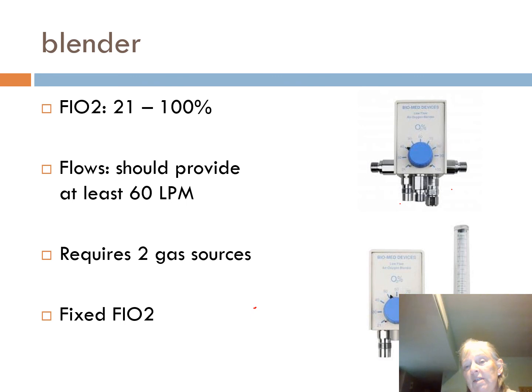This is sort of what we saw when you were in lab. When you're using this to deliver oxygen from here to a patient, you have to use a flow meter, okay? You set the FiO2 on whatever you want. Then we hook up a large volume nebulizer here, and we keep that on 100% oxygen.